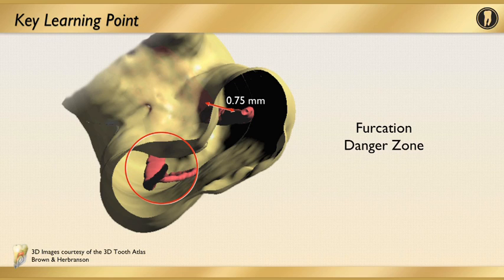Notice that in most cases, 0.75 millimeters or less than a millimeter is the distance that represents the actual axial wall of the canal preparation in about the area from the coronal to the mid 1/3 of the tooth. It is only 0.75 millimeters, or 7/10 roughly of a millimeter, in thickness. Over preparation in this area can lead to strip perforations.